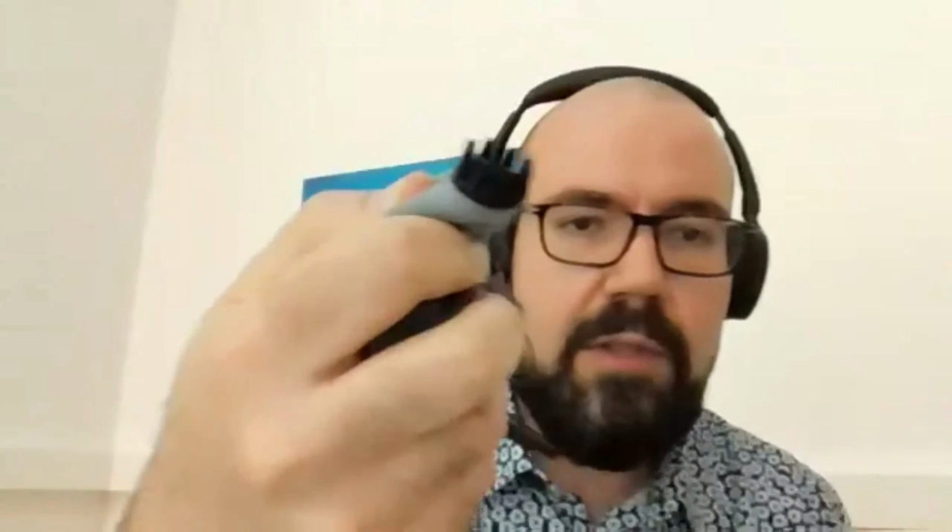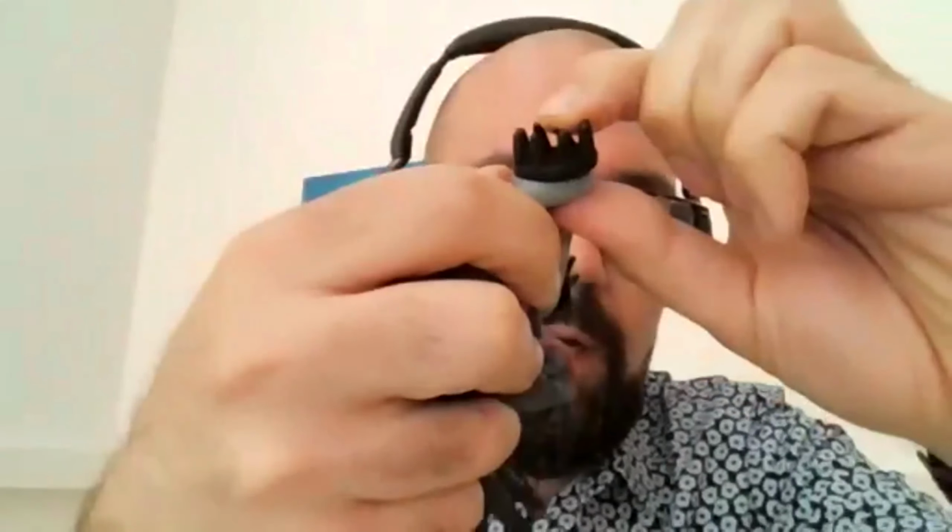And David wants to know, are the dry electrodes uncomfortable after a longer time? It will really depend. It depends also on how much hair you have. For me, because I don't have any hair that is damping the electrodes, after many hours it can be uncomfortable. But you can see the new kind of electrodes.